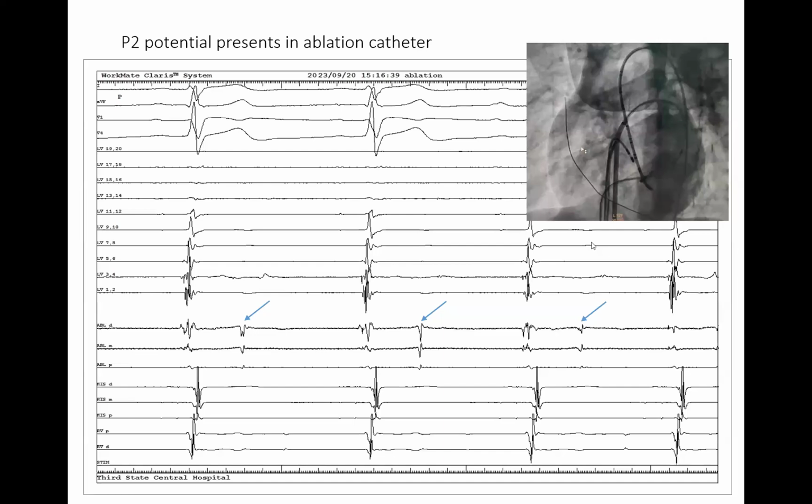As we know, from the ablation catheter, we can insert from the transaortic approach, but still the ablation catheter cannot reach the mapping site, cannot reach the ablation site clearly, and it will move again with the heart movement.